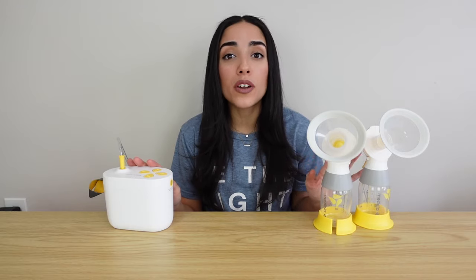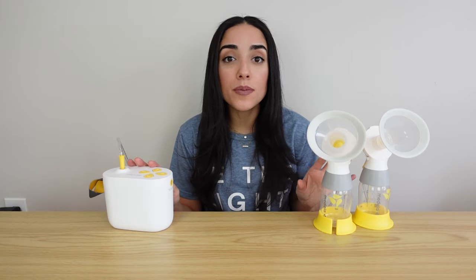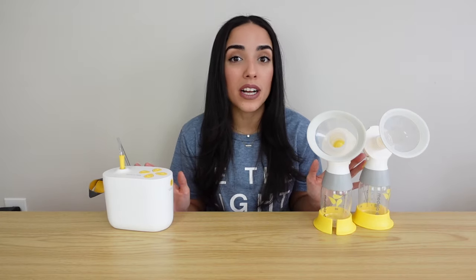The first thing I want to go over is pricing. Here in the United States, this pump runs for about $200. I personally purchased my pump at Target — I saw it on their website for $200, but in the store it was about $230. I asked them to price match and was able to save money that way. So if you find this pump cheaper on their website, you can always ask them to price match you.